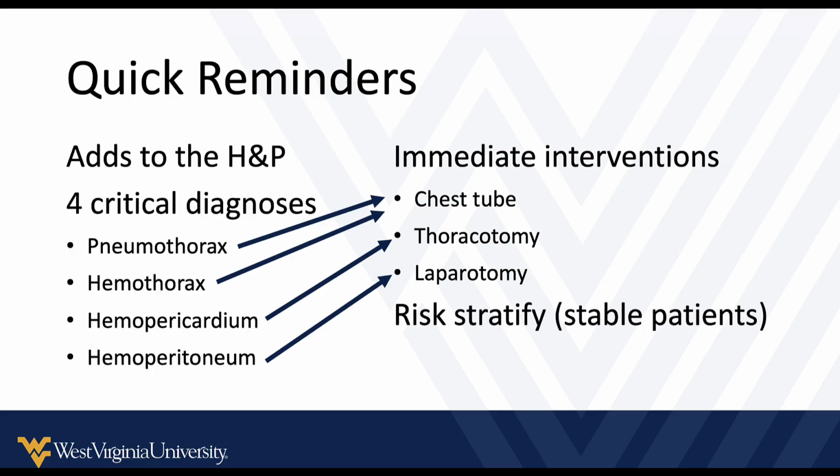Now, in patients who are more stable, the FAST exam, again, added to your history and your physical, may help you risk stratify these patients and help you make decisions on who needs the most resources first, because most of the time trauma doesn't happen in isolation. Trauma happens, sometimes there's multi-trauma, or trauma happens in busy places where other things are going on and decisions need to be made of who gets the most attention from your nurses, who gets the most resources, who goes for advanced imaging first.